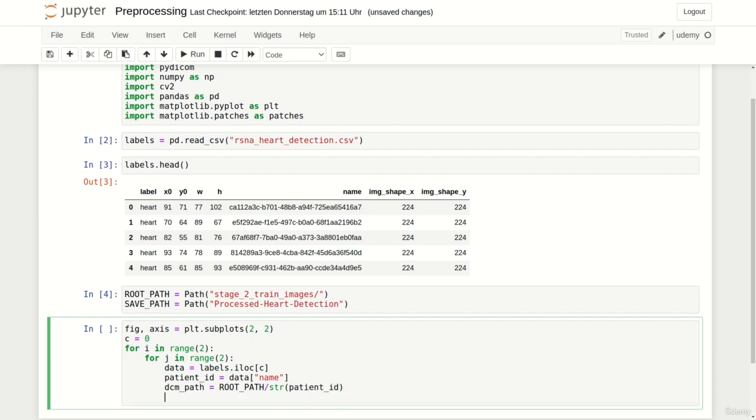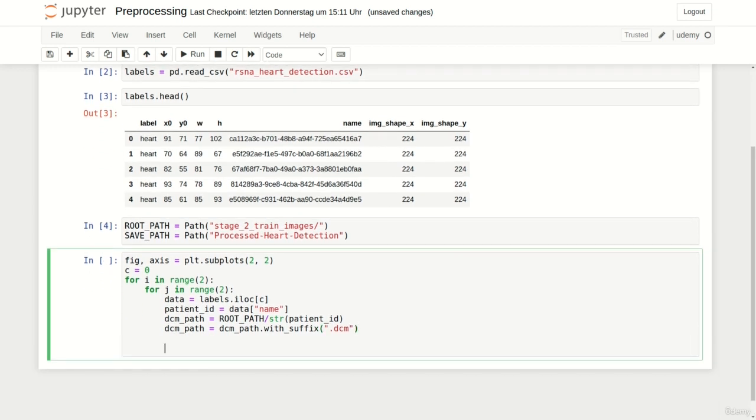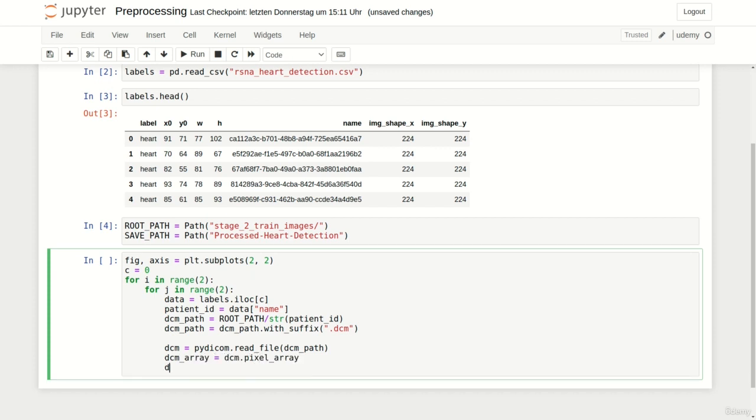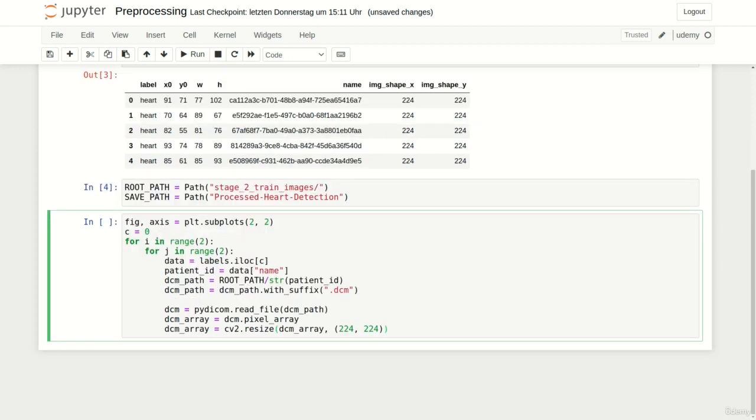To finally create the path to the DICOM file by concatenating our root path with the patient ID converted to a string. Last but not least we have to add the file extension by using the with_suffix function and simply adding .dcm. We are now able to use pydicom.read_file and pass the DICOM path.